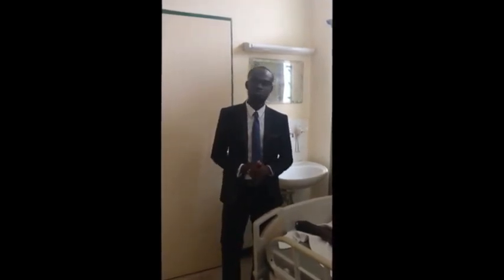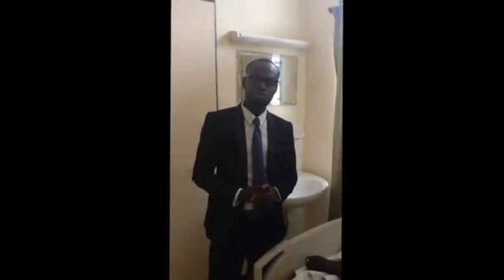I made this video during my audits, the title being Documentation and Correct Usage of Anti-embolic Stockings. The main aim of this video is to educate medical practitioners and the nurses concerning the correct usage of anti-embolic stockings, the important things that one needs to know when using them, and then whether it has been correctly documented. Basically, venous thromboembolism comprises two things.